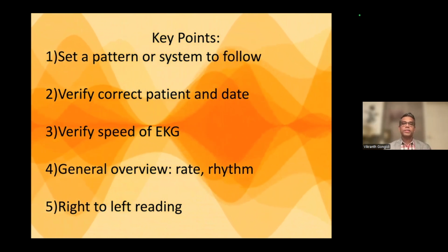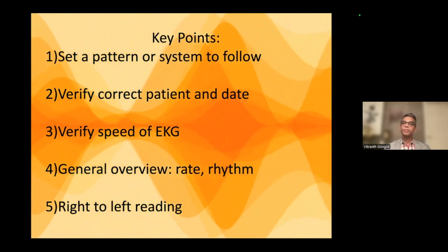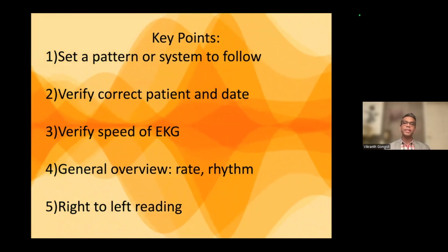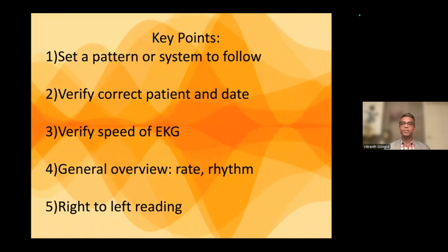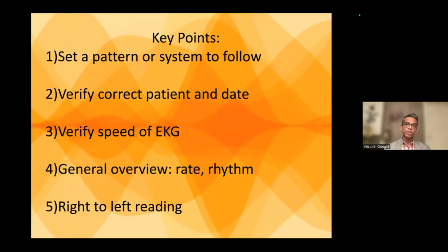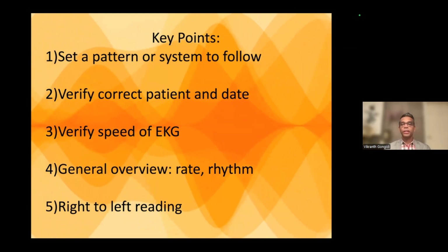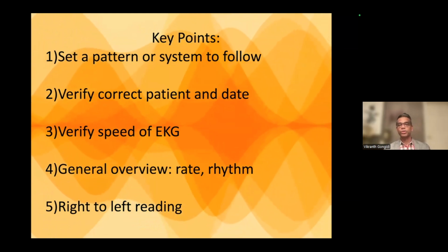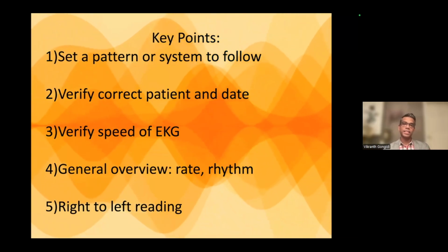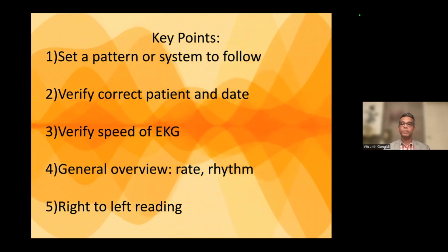The first thing, when you're reading an EKG, make sure it's the right patient, and also make sure it's the right date. It's the basics. It sounds silly, but you won't believe how many times the wrong EKG gets into the chart, and all of a sudden the nurse or the resident is calling you, freaking out that there's been a change in the EKG, and consulting cardiology, when all they had to do was check: when the patient got transferred from the ER to the floor, the wrong EKG got scanned. By the time it gets into medical records, it may not be there. So sometimes you're relying on paper records. So always verify that it's the right patient and the right date.